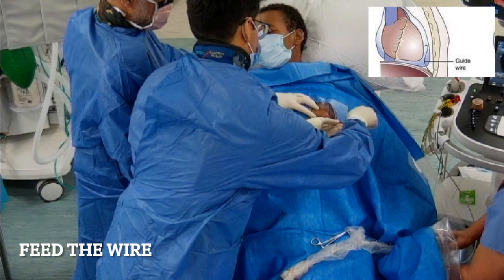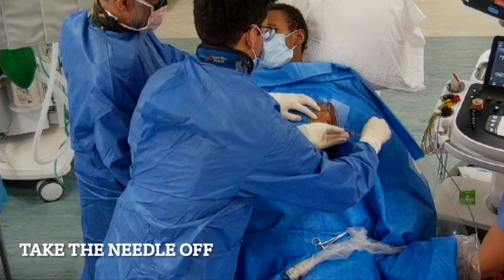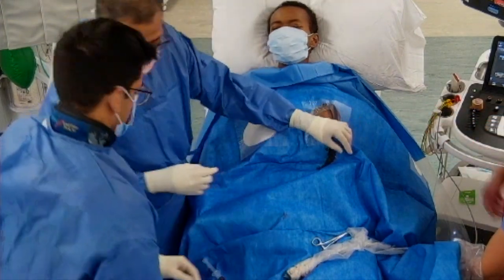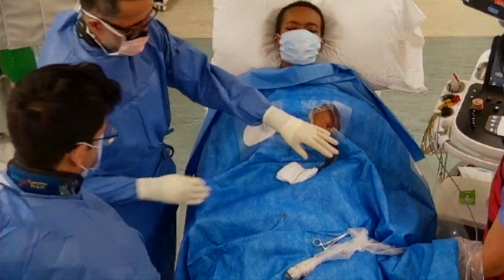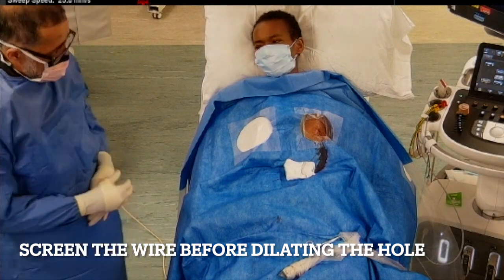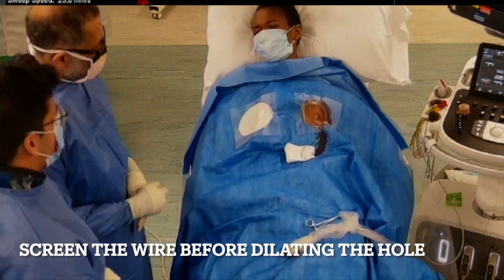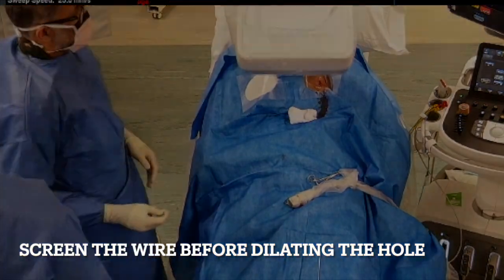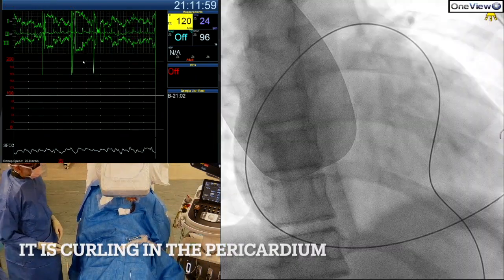We now feed the wire into the pericardial space through the needle, holding the needle very still. Once a generous length of wire is in, we remove the needle. We place a wet swab on the wire to hold it still, then bring in the X-ray machine to screen the wire. We should see it in a circular position in the pericardial space surrounding the heart — and there it is, curling around in the pericardial space.